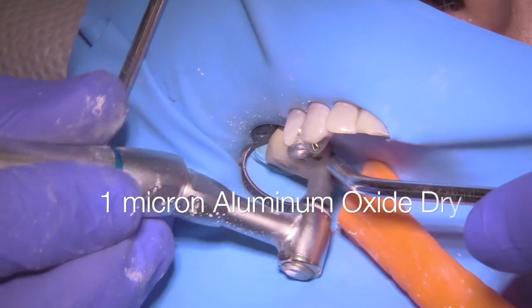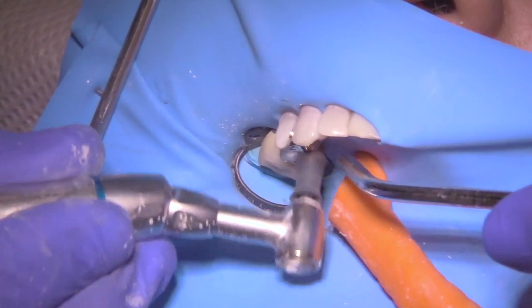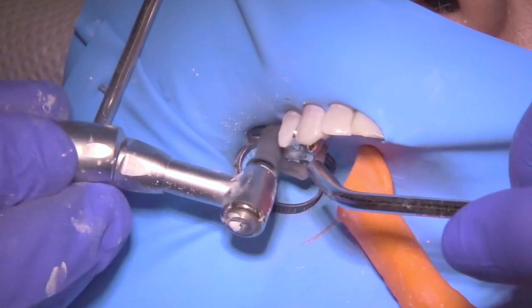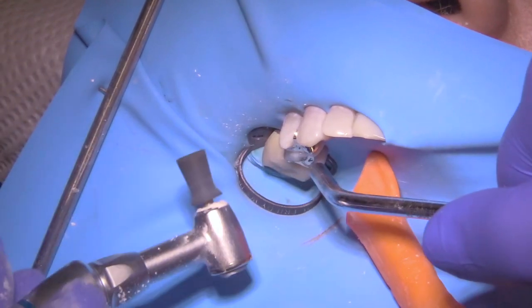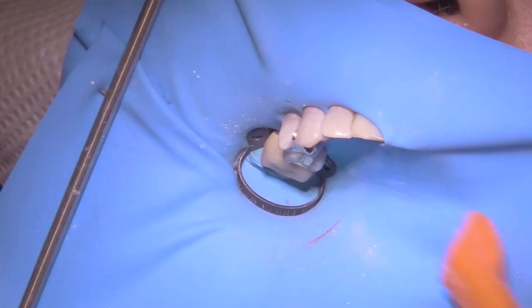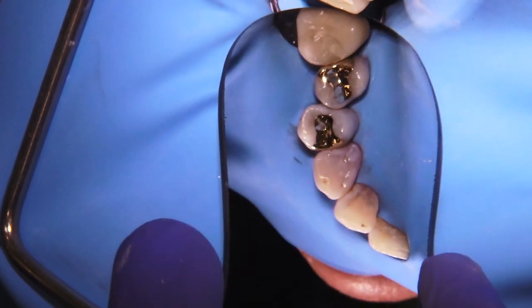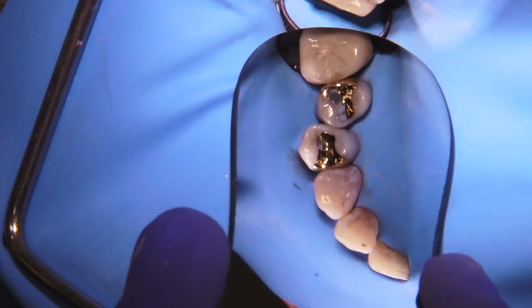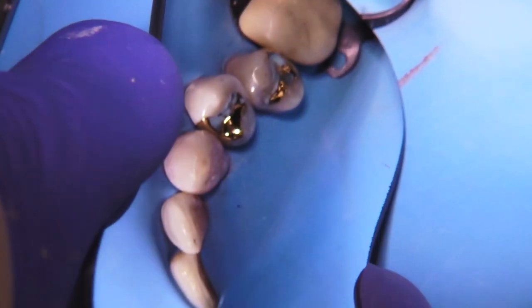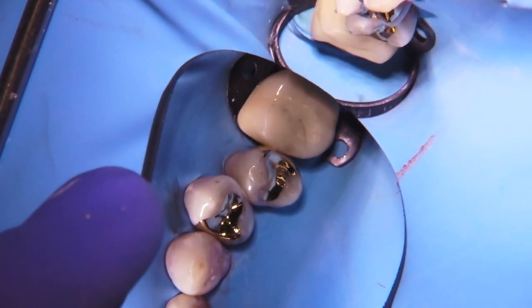Now I'm going to go back to the one-micron aluminum oxide, but this time used dry. The dental assistant uses suction and air spray together simultaneously as I apply the material, minimizing powder getting all over the rubber dam for a cleaner final photograph. The castings have finished out very nicely — never perfect, but in the category of very nice. Hopefully they will last the patient a lifetime. That's the goal with cast gold dentistry: lifetime dentistry. I hope you enjoyed this final video in the series — stay tuned for more.